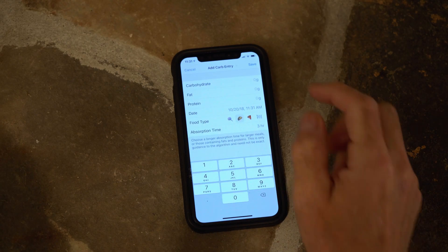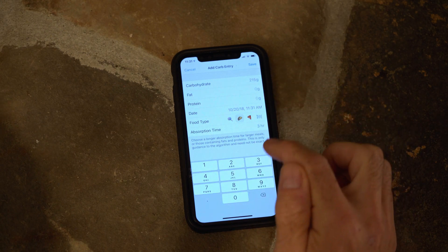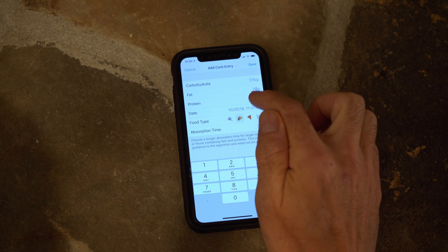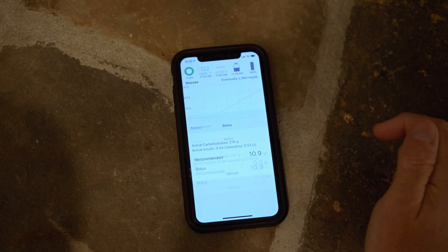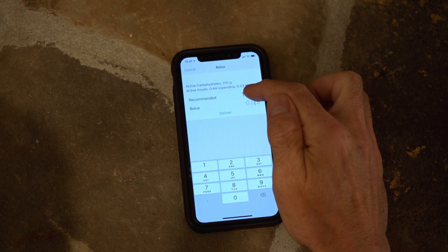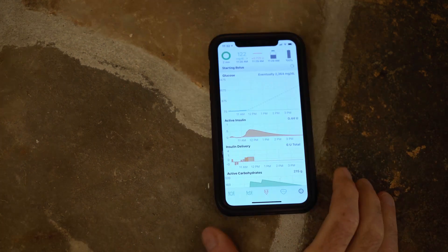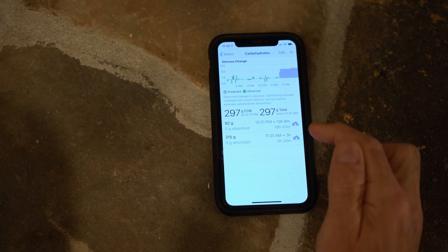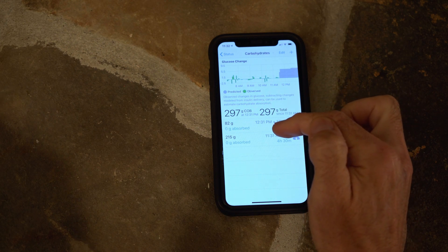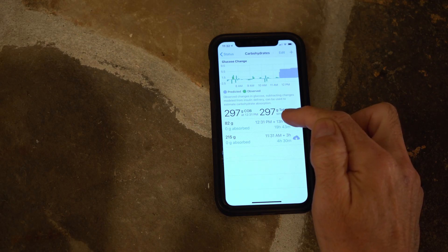Now we are going to put in that meal — 215 for carb, 76 for fat, and 94 for protein. It's recommending the initial bolus, which we will go ahead and give. You can see it created a two-tier equivalent carb profile: an immediate entry for 215 grams of carb, then the equivalent of 82 grams of carb with a one hour delay, distributed over 13 hours.